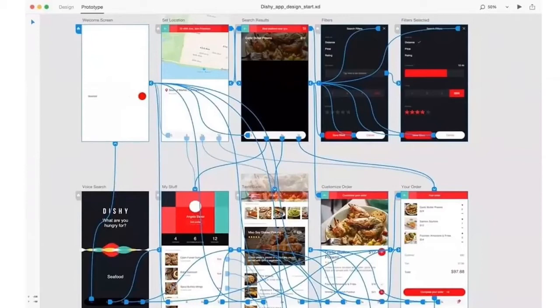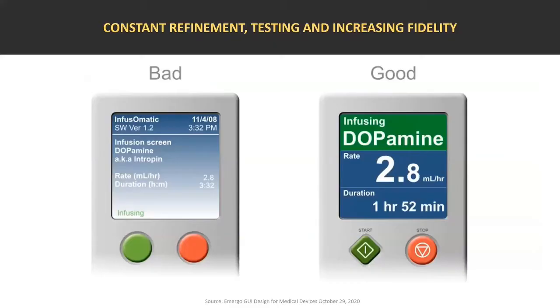So this is another example of a commercial tool. This is Adobe XD, which is another way of putting things on devices. And again, all the little interactive things here are trying to work out what if. You've always got to give people a way of navigating easily, otherwise you confuse them and you've failed. There's always got to be some way of coming back to where you came from, and so on. So this is continual refinement and testing, and also consideration of standards.